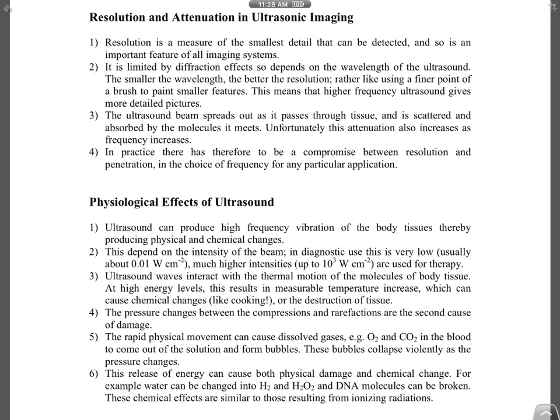But will there still be damage? We won't know, but there is a small chance. Which is why in developed countries, where they are more aware of the side effects of ultrasound, they don't encourage pregnant ladies to go for ultrasound all the time. Whereas in Malaysia, every time you go for a checkup, if you're pregnant, they will always ask you to do an ultrasound. But it's not encouraged in other developed countries because of the risk of damage to the cells. So ultrasound is not completely safe. But the downside is that because they're using low frequency, the resolution is very low. That's why you cannot see very clearly.